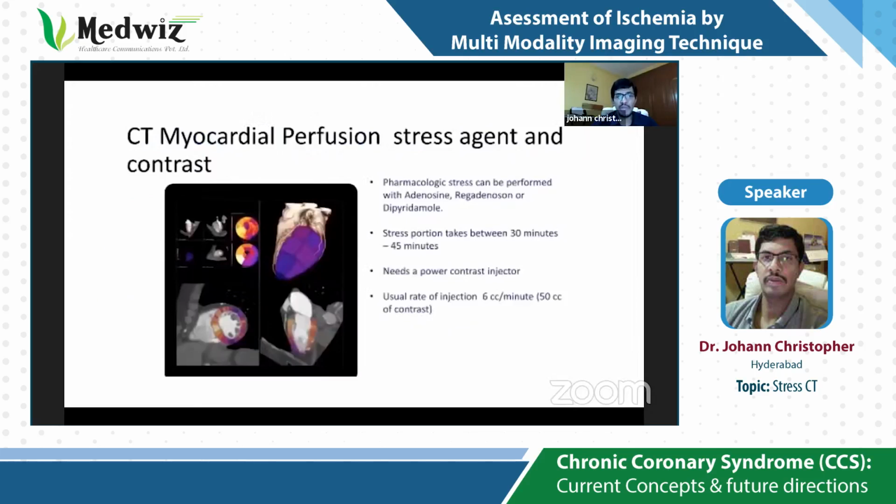In the end, with a well-prepared patient, you get exquisite images of both structure, that's the coronary, and you get these very good color plots talking about the perfusion.